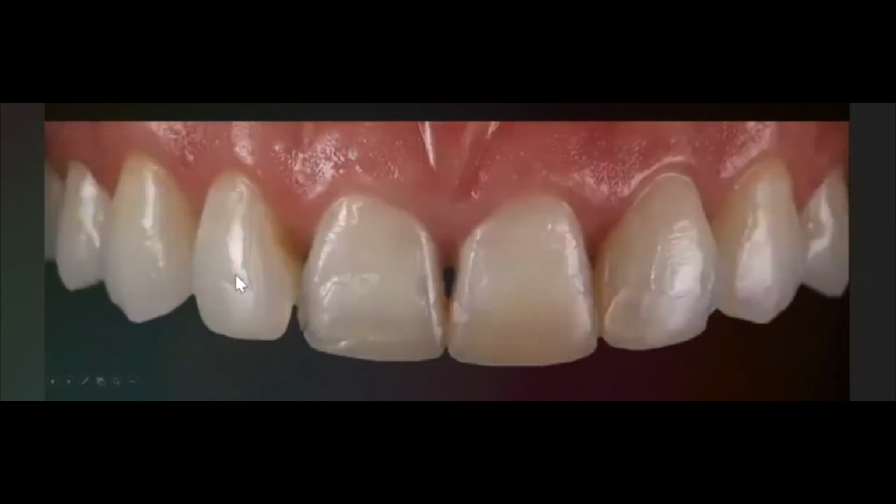And the last feldspathic case, she's a young lady as well. She had these composites here, and she wanted to replace them and to replace the aesthetic for anterior teeth. But the most impressive here, she's around 25 years old, but she has black triangles, open cervical areas. It's not so often seen in a very young person like this.